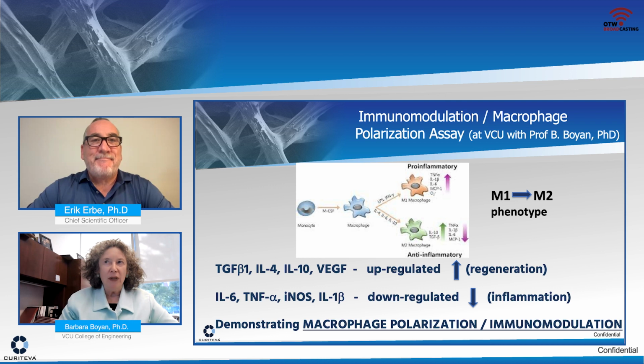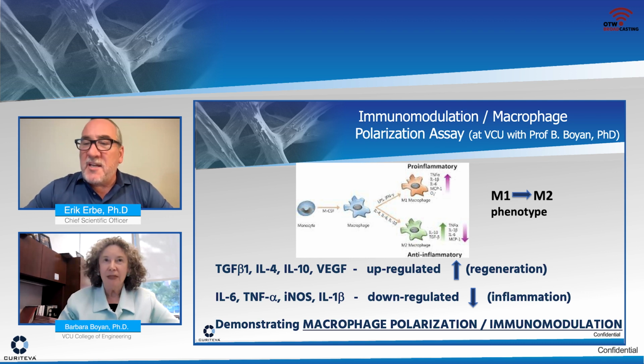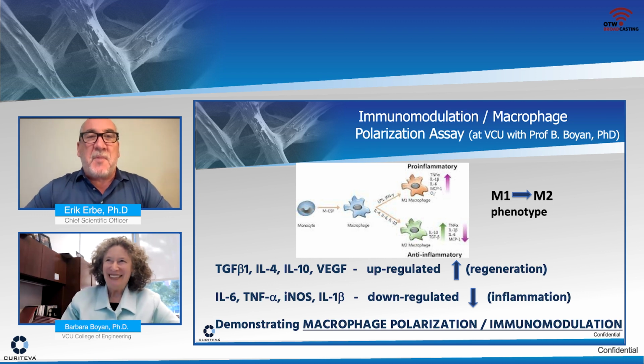You can get bone to grow a lot of different ways. It's not all about cells becoming osteoblasts. The bone has to form in a bone-conducive environment. And this surface is certainly setting up the immune response to be conducive to good regeneration of bone. So, Barbara, your insight into that was very, very significant for us. And if you recall, because of your and my past, a little bit of arm twisting, maybe, to think that we might even see anything interesting in this endeavor. And indeed, we did. Yes.